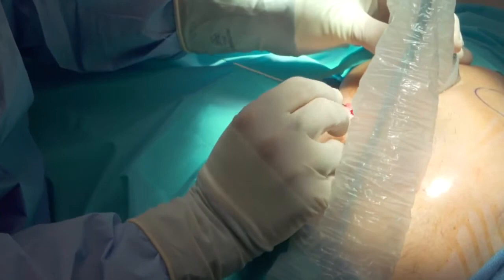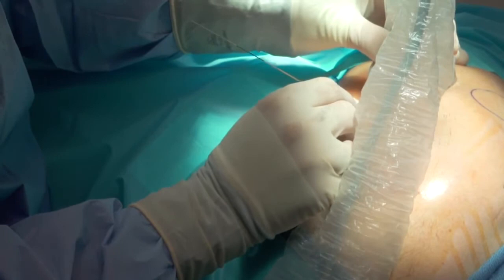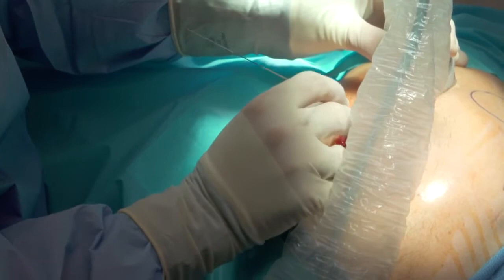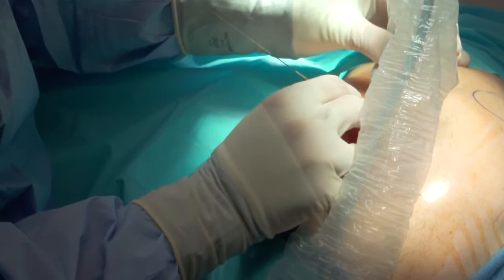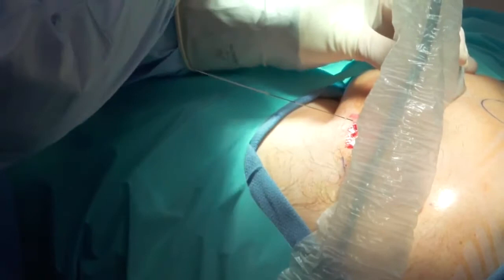Again, it's important to gauge your depth here. And remember that you're trying to utilize the needle and change the position of the needle, or of the probe itself, to accommodate your ultrasound. You really don't want too much give and too much movement of that ultrasound probe, because what can happen is, again, you're changing your entire picture when you do so. So I think we're pretty close there. Okay, great. No, I think we're good.